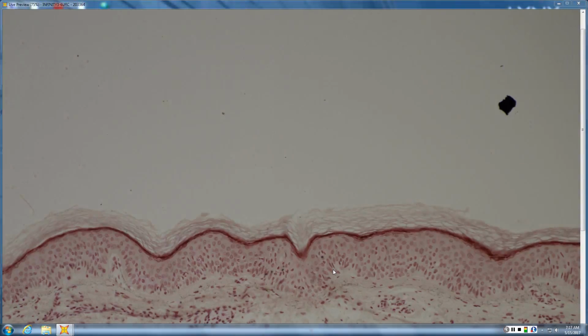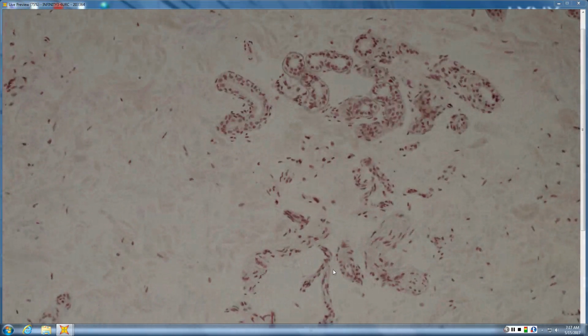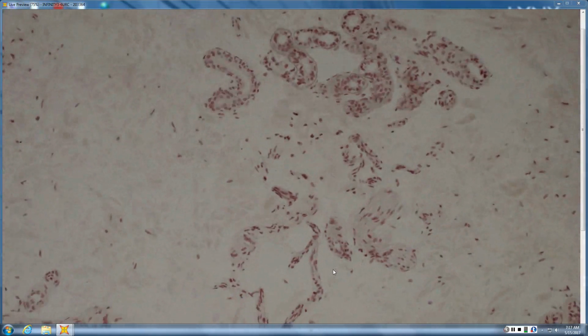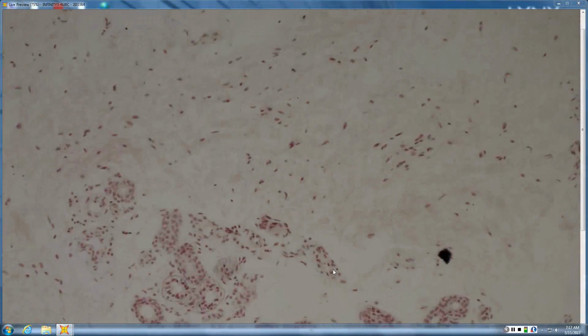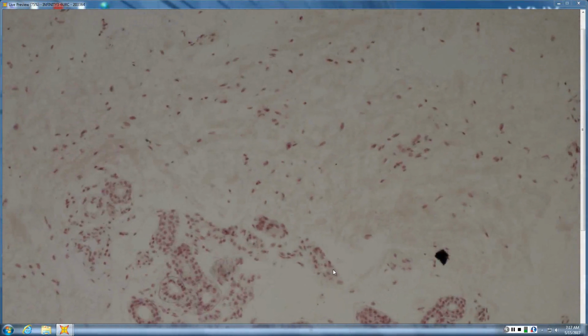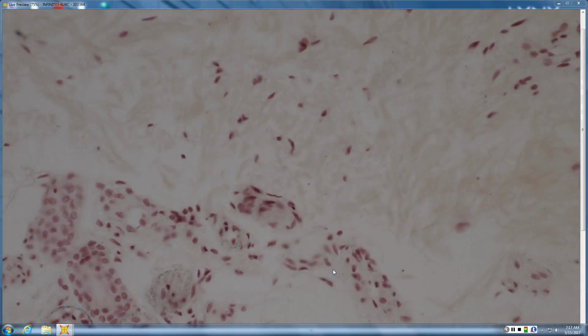There's maybe a hint of infiltrate around different places. But if you quickly try to go through that mnemonic, which I think is like "I vacuum dog pus" or something, there's different ones, but that's one of them. You'd come across argyria, and so you'd want to look down at the eccrine glands, because you also want to see are they necrotic, is it a coma blister or neutrophilic eccrine hidradenitis or something.